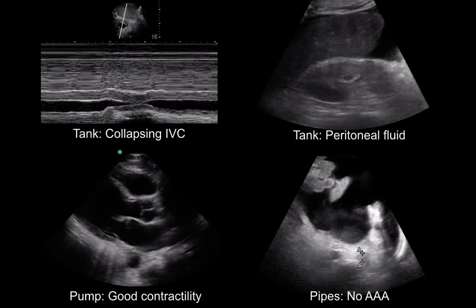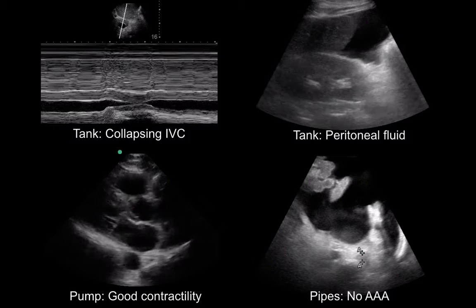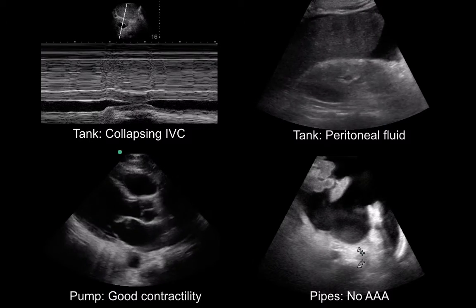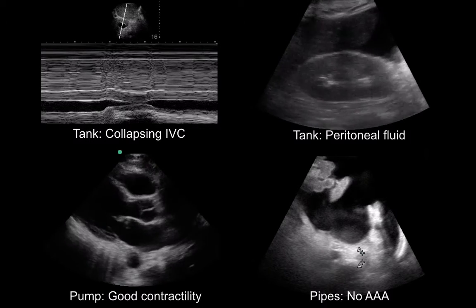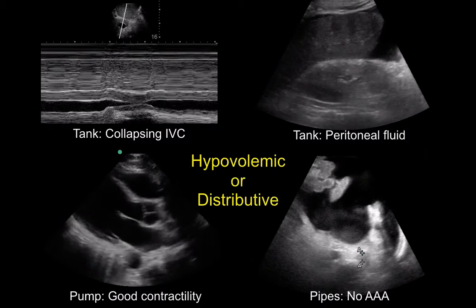Based on the collapsibility of the IVC, we know that this patient may benefit from fluids. This provides a context now to initiate resuscitation and with which to interpret the patient's vital signs and laboratory data as they become available.